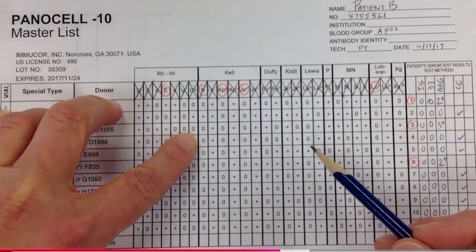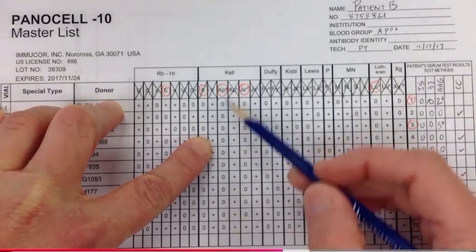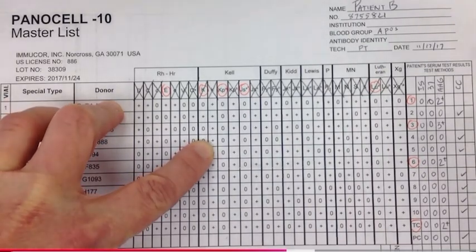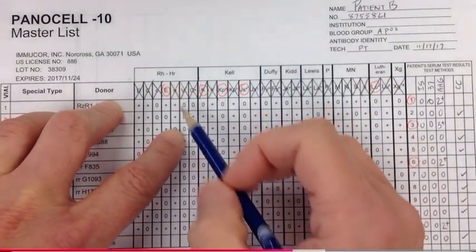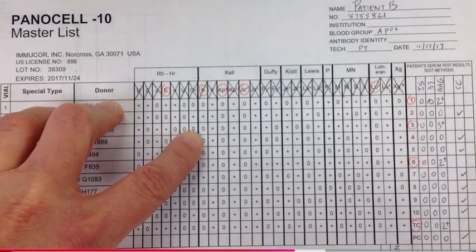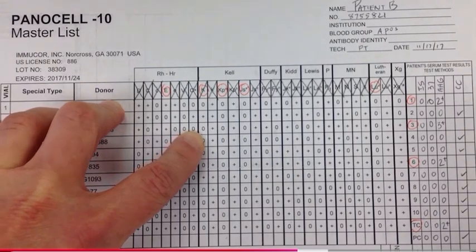Okay, so let's talk about low incident antigens. So here we can see KPA, it's absolutely 0. There are no positives here. So one way of looking at low incident antigens is that they tend to be ruled out because, for example, you would do something with them if you did a cross match and you determined that the patient had an antibody, and then you got units that were negative for that antibody, so you knew there shouldn't be any reaction, but then you did the cross match and there was a reaction.